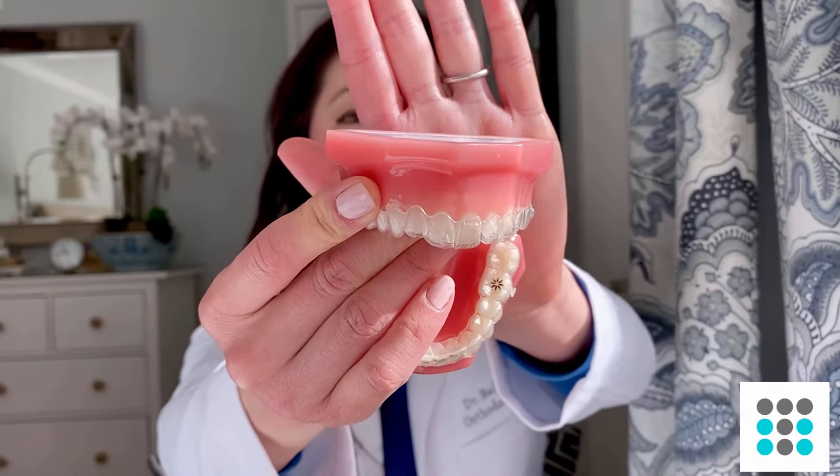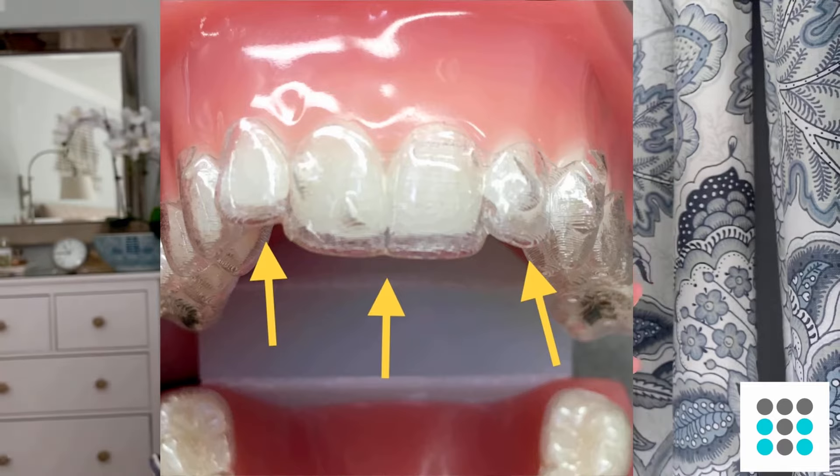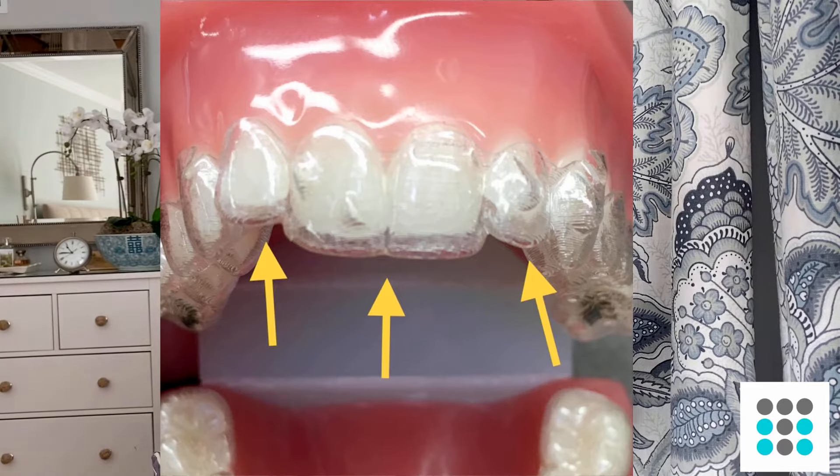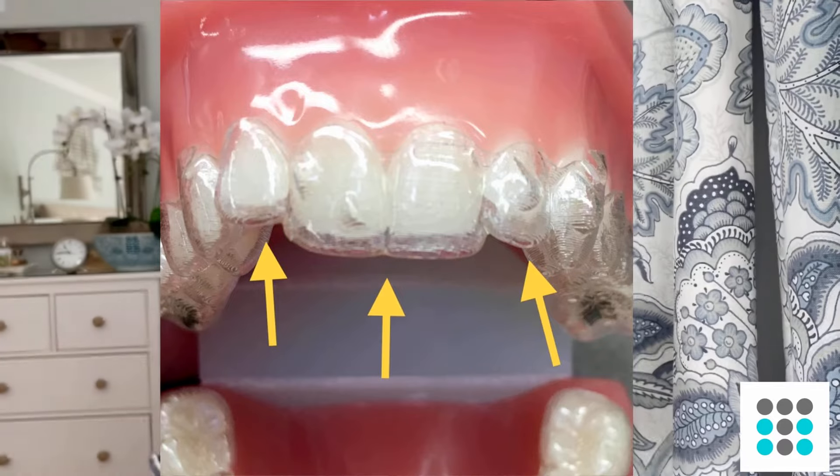A lot of times when you first put your aligners on, you're going to notice a little bit of what's called a halo effect. So here's an example — you'll see that there's a little bit of a gap on the central incisors where you can see a halo. A halo is basically a gap between your teeth and the aligner. In order to get your teeth to move better, you actually want to seat the aligner higher up.